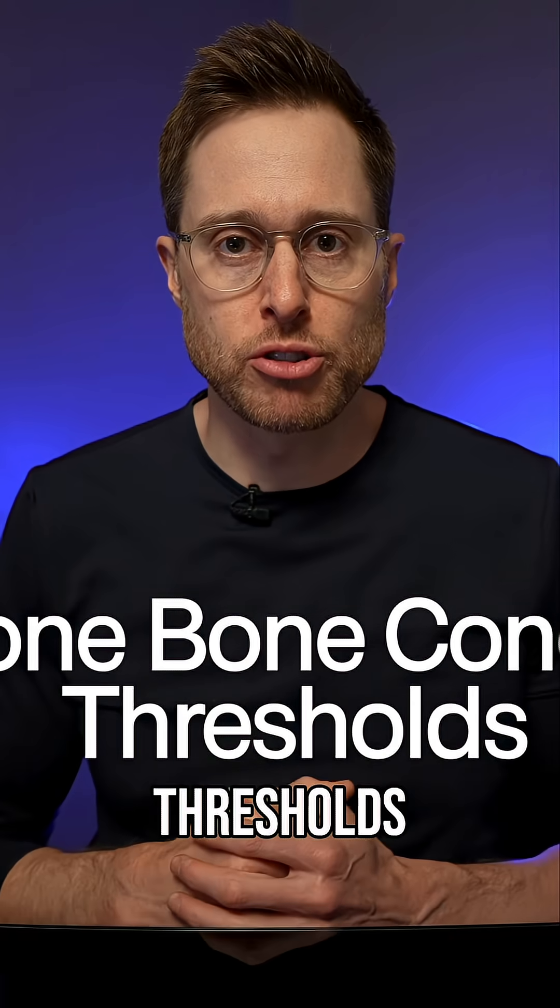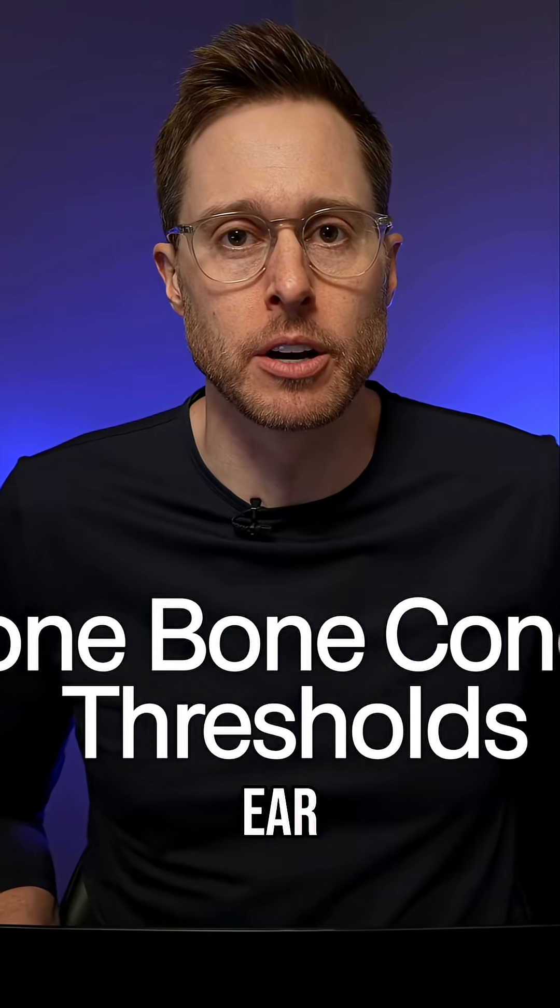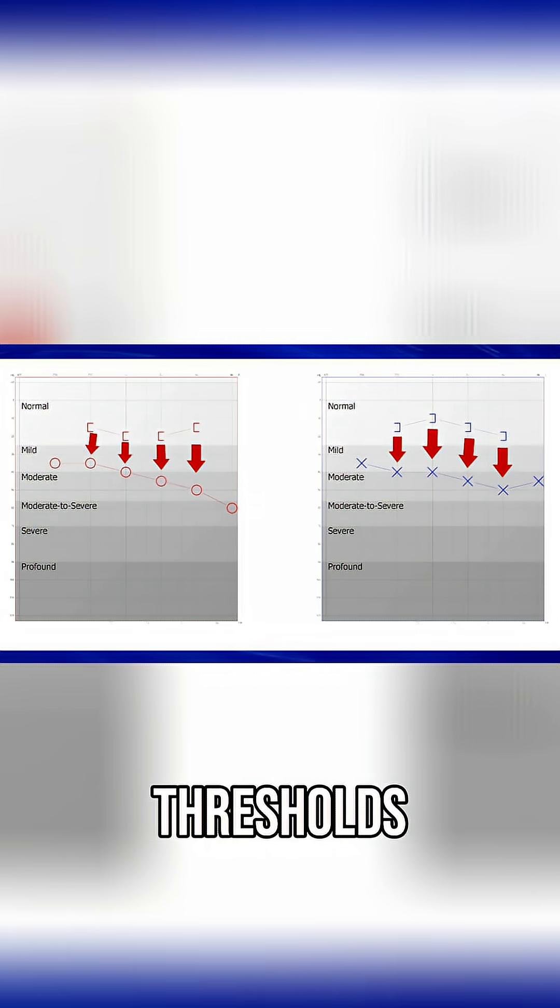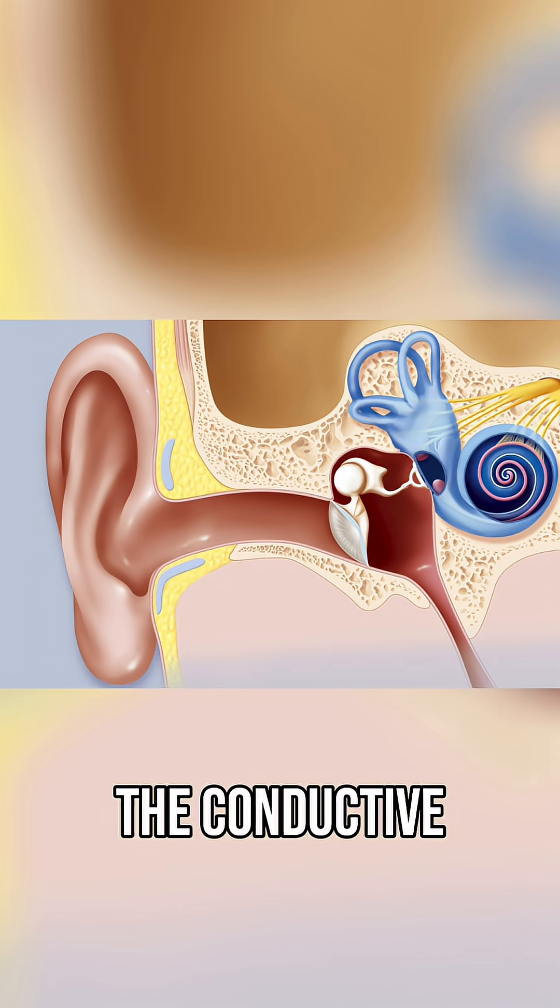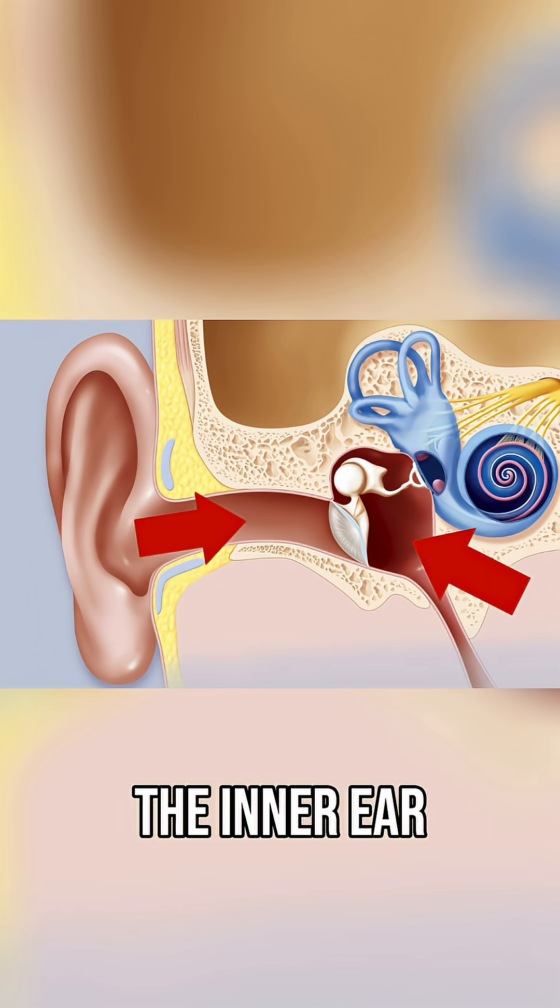Pure Tone Bone Conduction Thresholds indicate where the hearing loss is actually located inside of the three parts of your ear. If there's a gap between the air conduction thresholds and the bone conduction thresholds, it can indicate an issue with the conductive pathway of sound through the outer ear or the middle ear on the way to the inner ear.